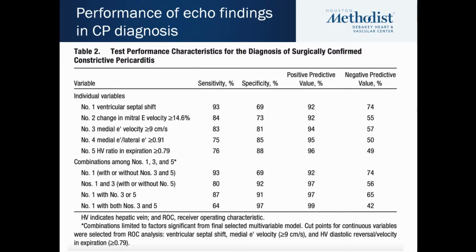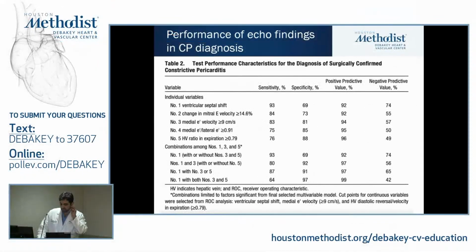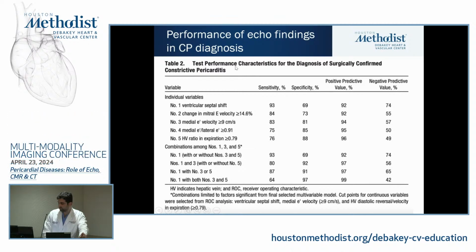Putting all of these together, the Mayo Clinic has come up with criteria to try to improve the accuracy of echo diagnosis of constriction, and this is a series of people who were confirmed to have constriction on surgery.